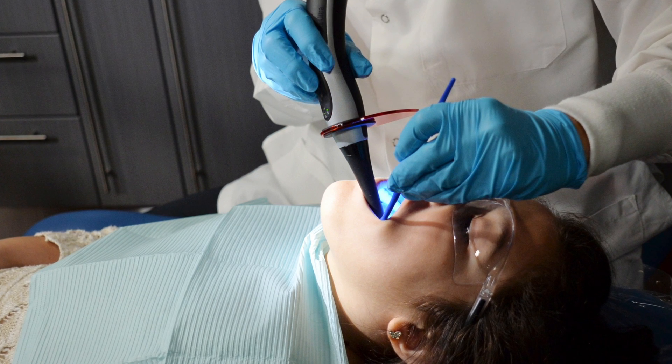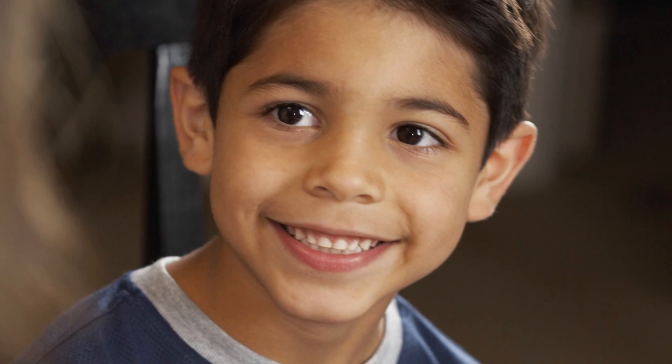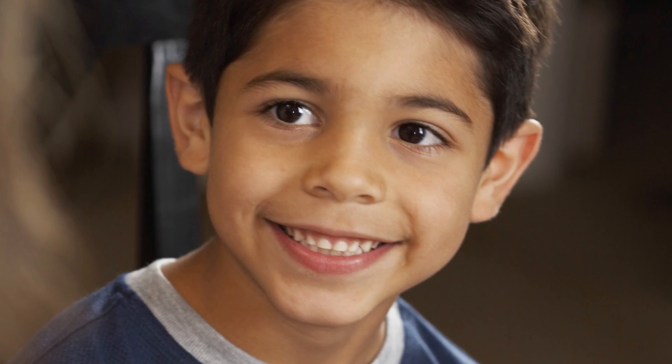Anyone can get a sealant, including adults, but children and teenagers are often the best candidates since the earlier you can place this protective barrier on the surface of your tooth, the less likely you are to develop a cavity.